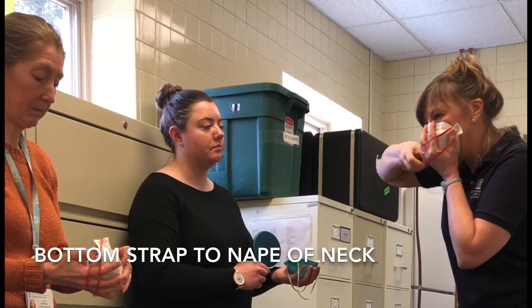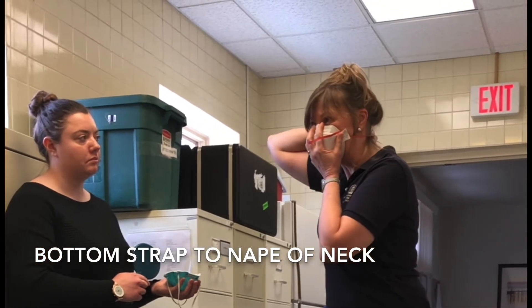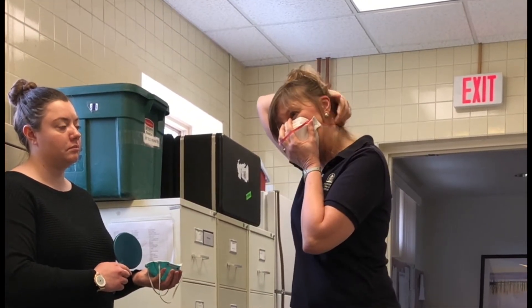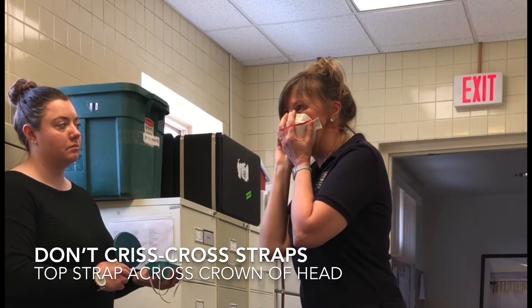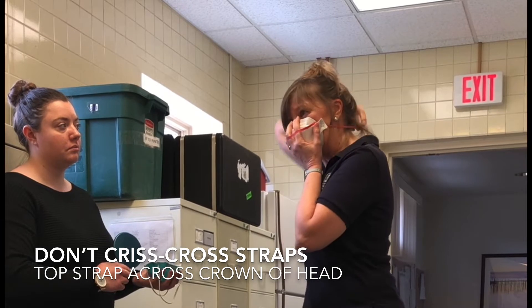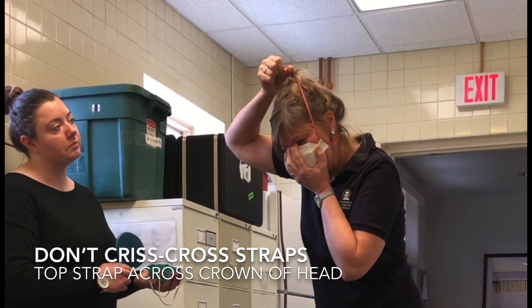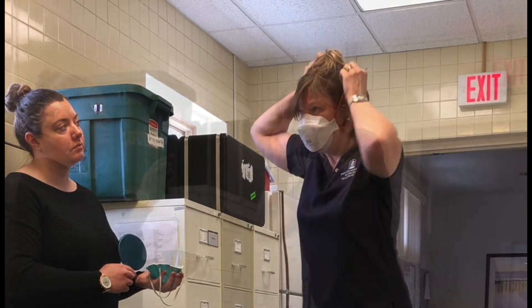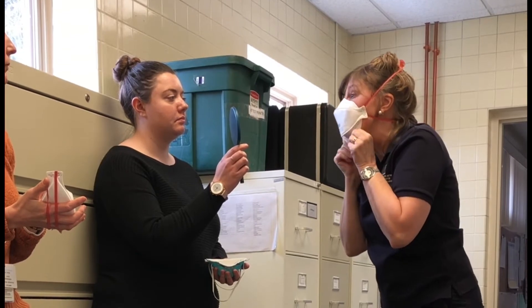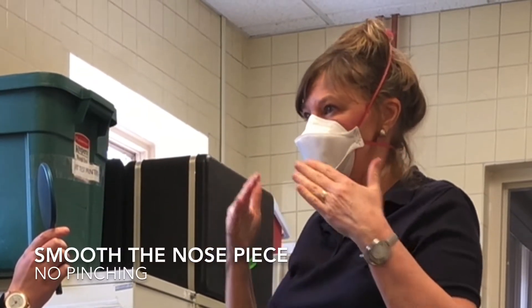Then you take the bottom strap and you pull this over your head to the nape of your neck, below your hairline. You want to try to make sure that the straps are straightened and they're not twisted, mainly because it's uncomfortable after a while if they're not on you straight. Then you take the top one and you pull this slowly over the top of your head to the crown of your head. Make sure that this is positioned properly over my nose, that this is under my chin, and then the next step is fitting it to your nose.